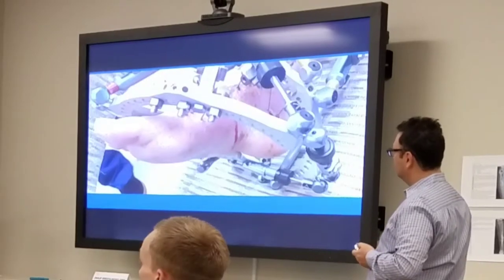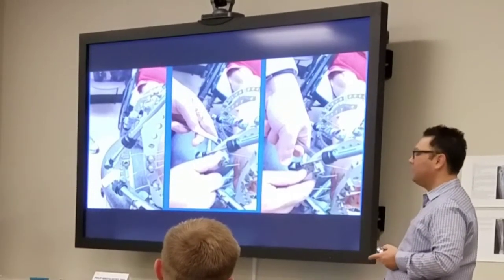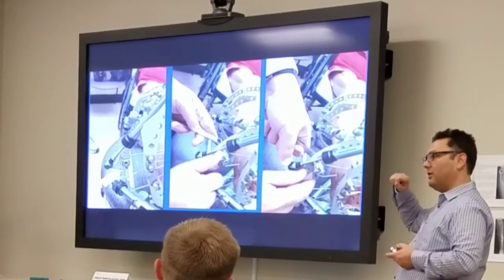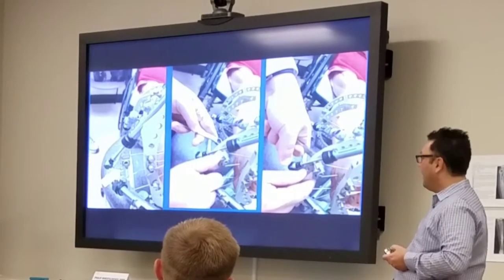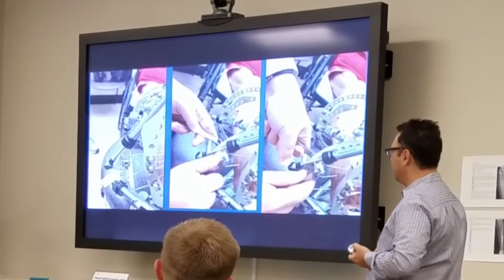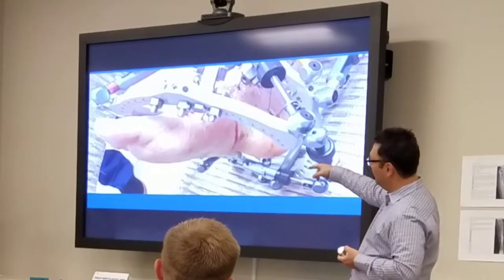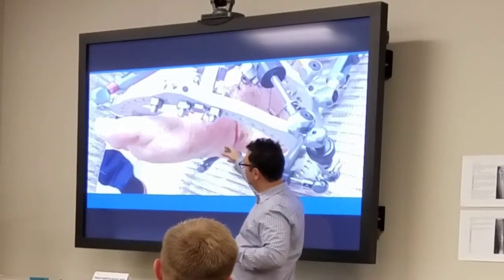I think that was before the emergency tabs came up. Even if it wasn't, this was something that we didn't predict because of the rotation that was going to bump in. Yes, I could have just put on an emergency tab as well. We didn't think of that, and it wasn't out yet. So here's that correction in the end. You see how that cuboid is now nice and up in the air.